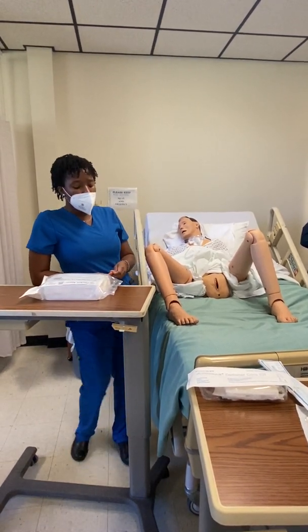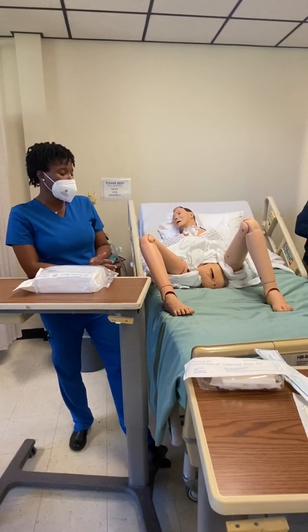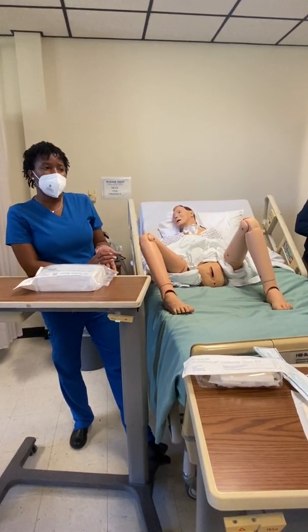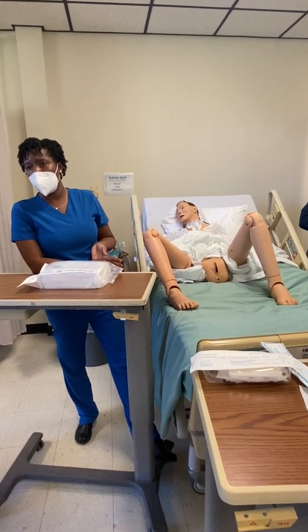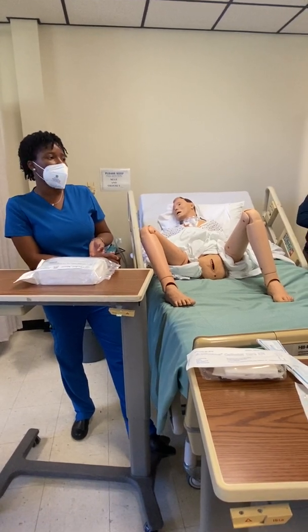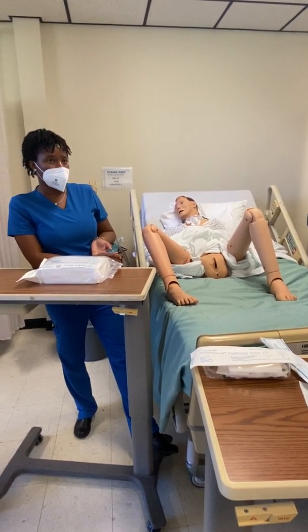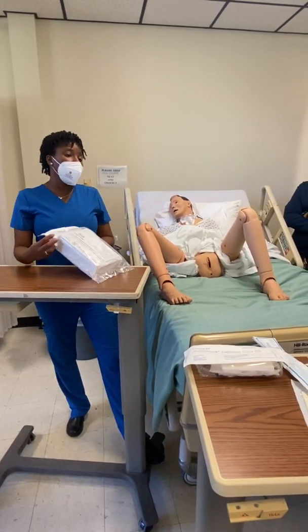Okay? You'll see where some people will choose to do everything from the bedside table. I don't recommend that. Because when I move from this bedside table, what do I do? Turn my back to the sterile field, and that's a violation of one of those 7 principles. Okay, so I don't recommend that, but to each his own. You know, whatever you choose to do.